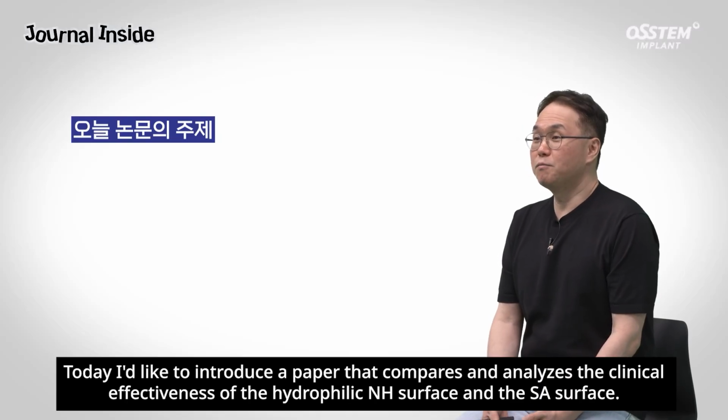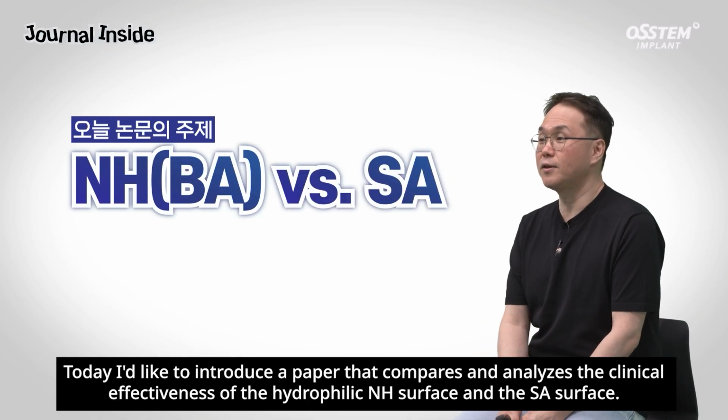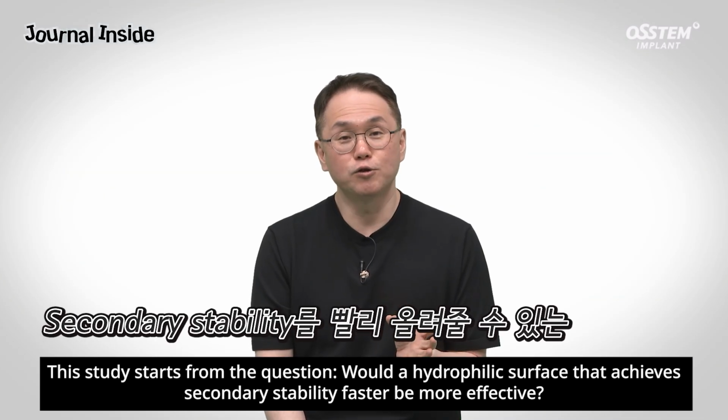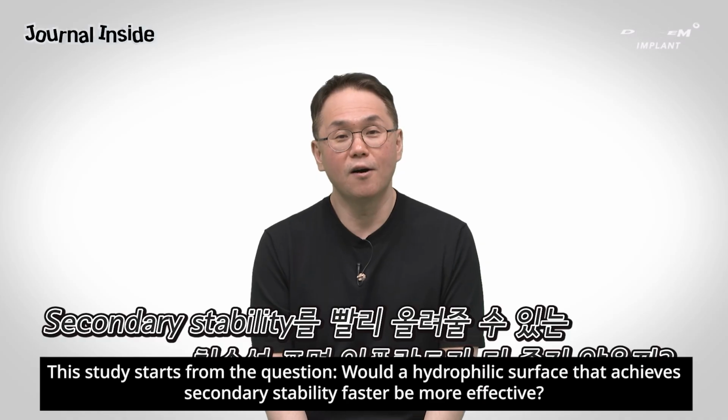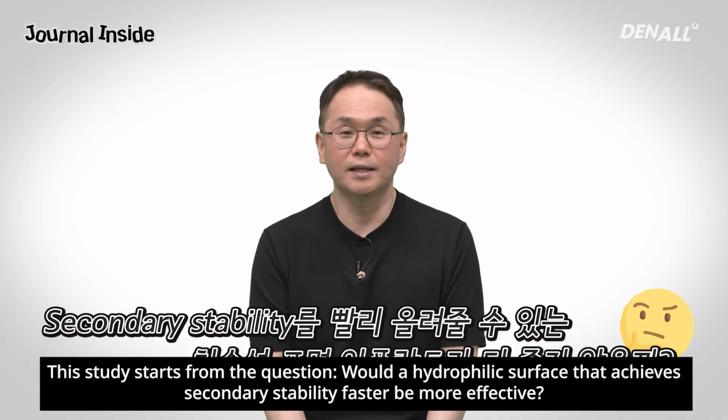Today, I'd like to introduce a paper that compares and analyzes the clinical effectiveness of the hydrophilic NH surface and the SA surface. This study starts from the question, would a hydrophilic surface that achieves secondary stability faster be more effective?